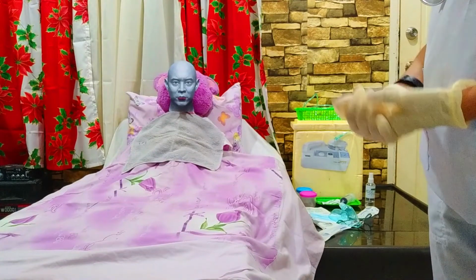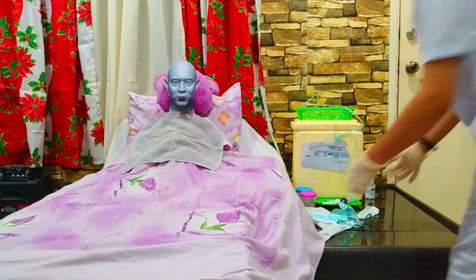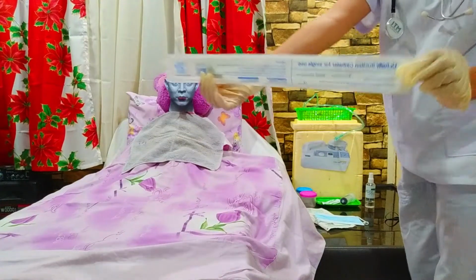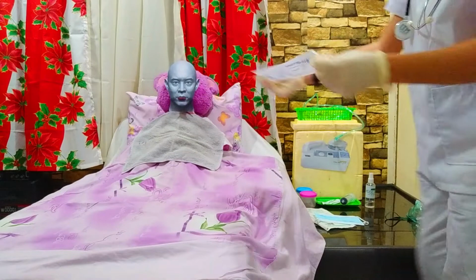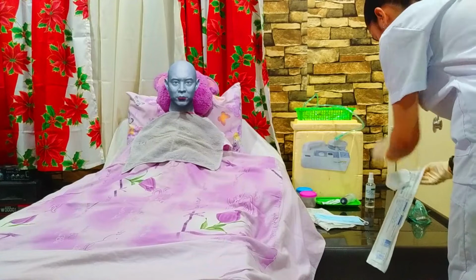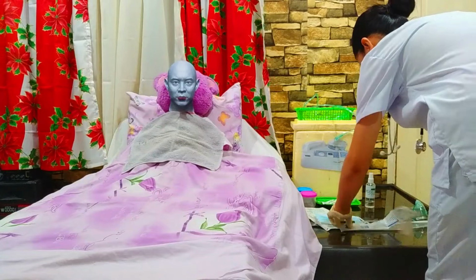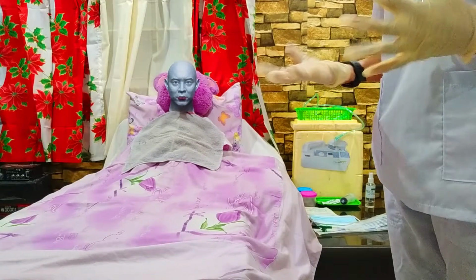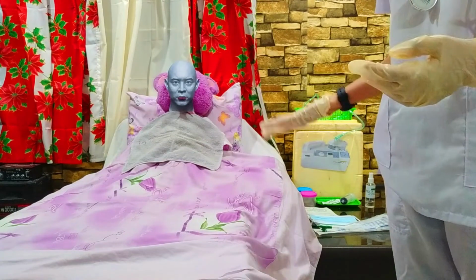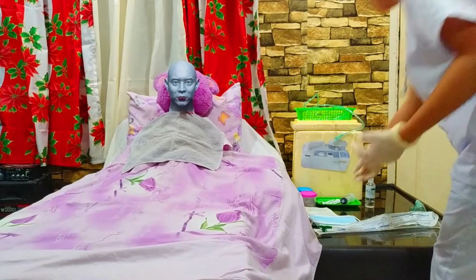And we need to open the sterile suction package using aseptic technique. We need to place a small amount of water-soluble lubricant on the sterile field, taking care to avoid touching the sterile field with the lubricant package.